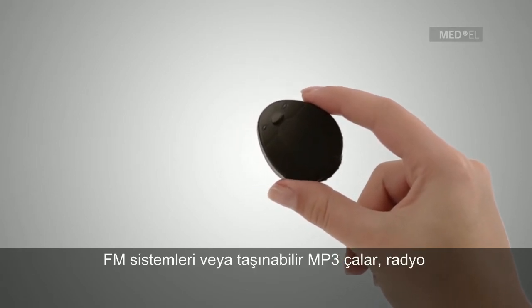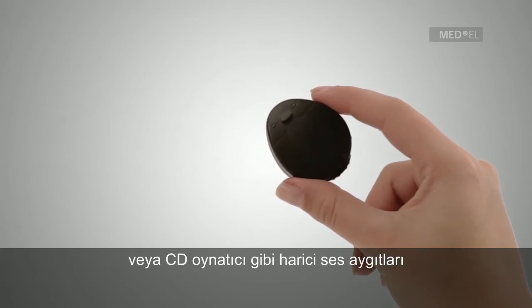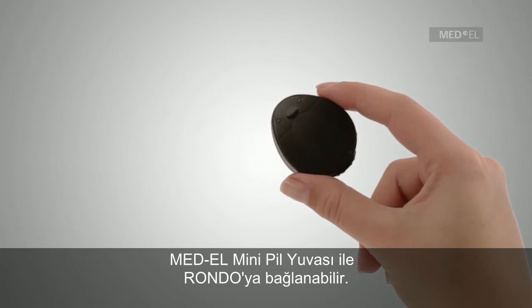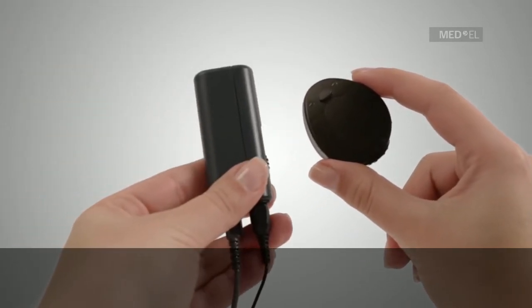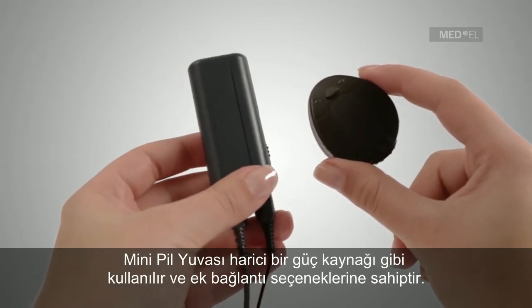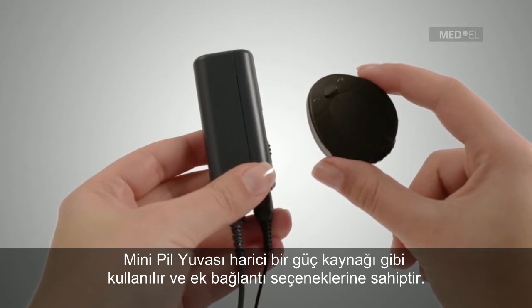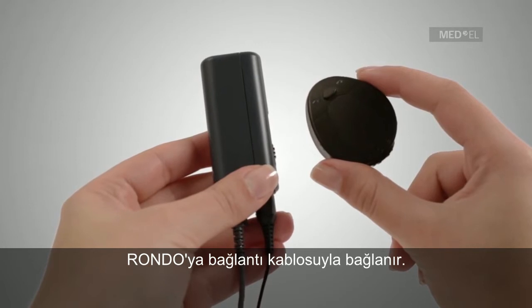Assistive listening devices or other external audio devices, such as portable MP3 players, radios or CD players, can be connected to the Rondo via the MED-EL Mini Battery Pack for Rondo. The Mini Battery Pack is an alternative external power supply with additional connectivity options, and is connected to the Rondo Control Unit via a connection cable.